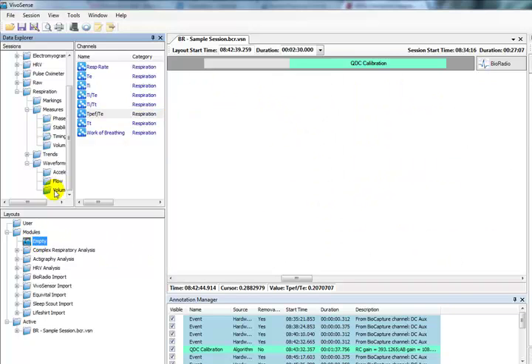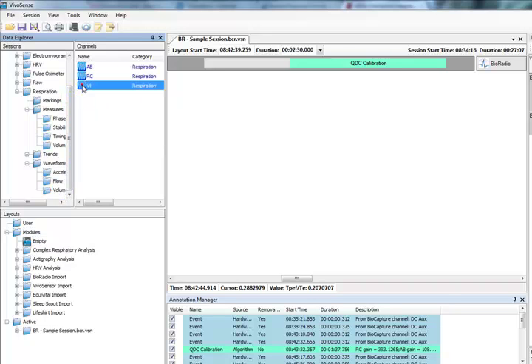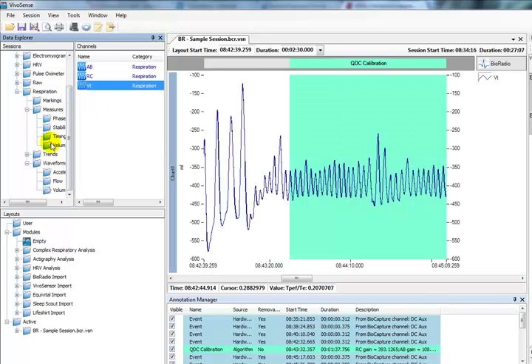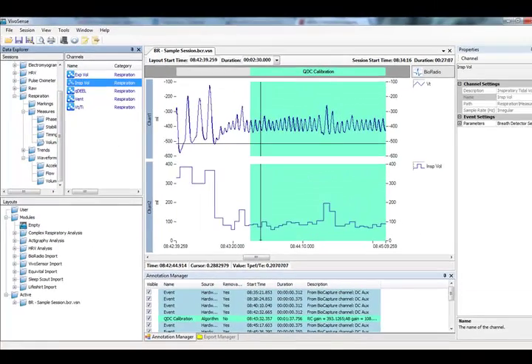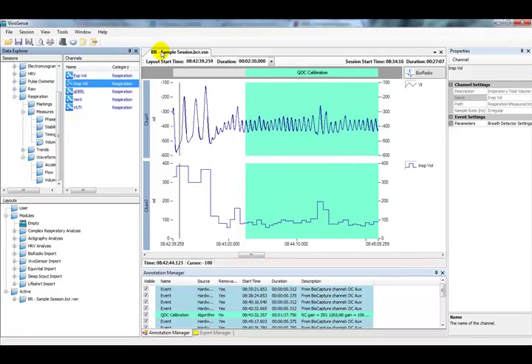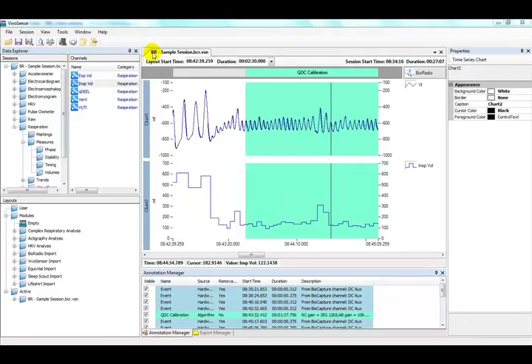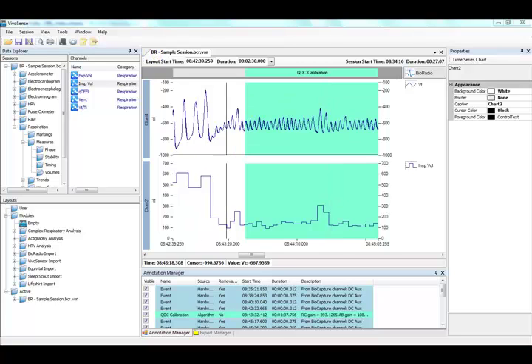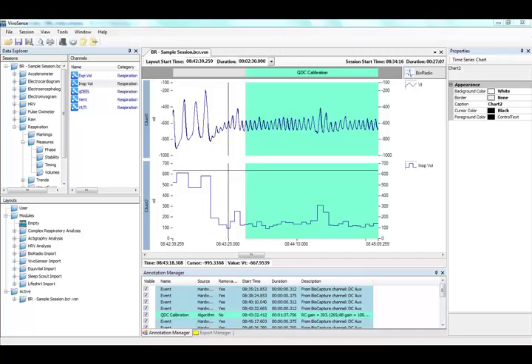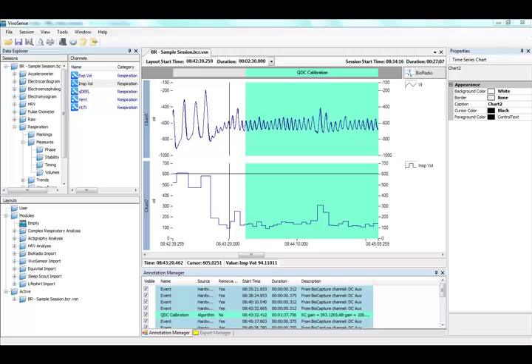Dual band RIP and the VivoSense complex respiration analysis module also enables us to quickly create relevant 2D phase plots, which may assist us in identifying suitable breaths for analysis and provide an additional visualization tool to assess synchrony, possible pathology, and effect. A phase plot is a visualization of one data channel versus another data channel within a given phase chart. Let's create a typical flow volume loop, which is a common 2D phase plot to assess the presence of upper airway obstruction based on the shape of the loops in the plot.